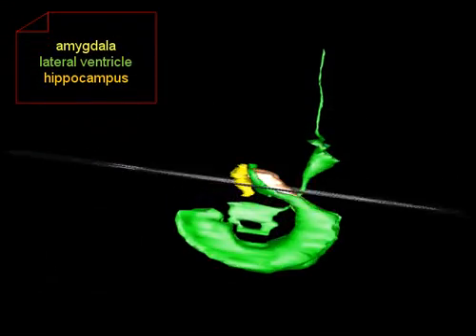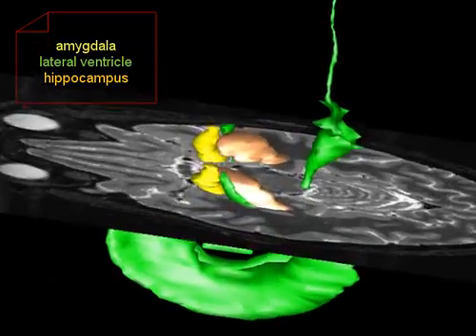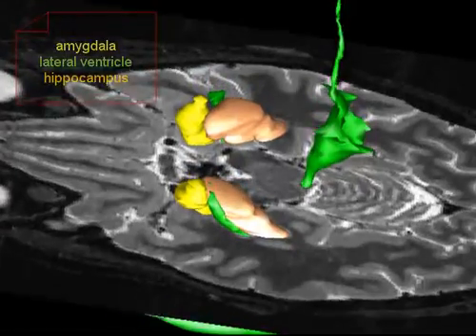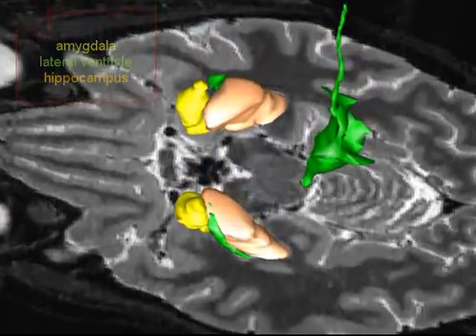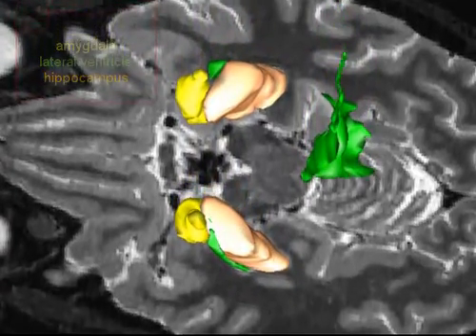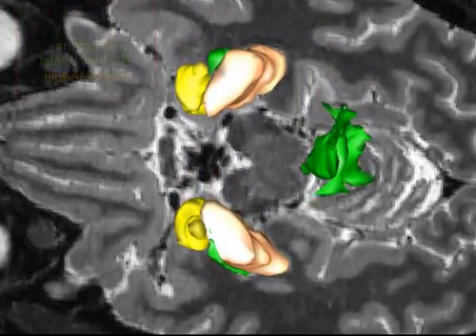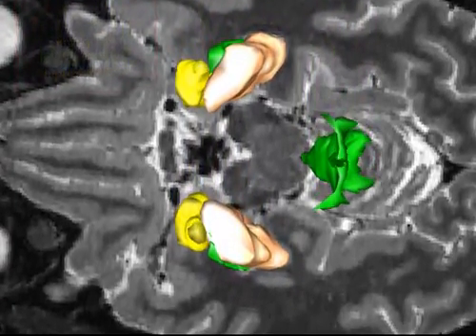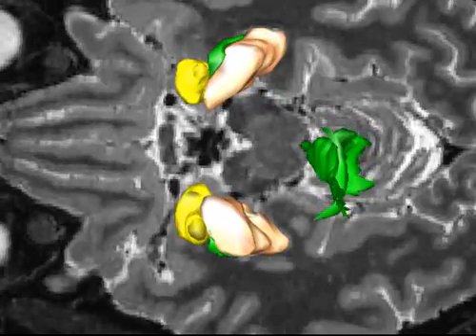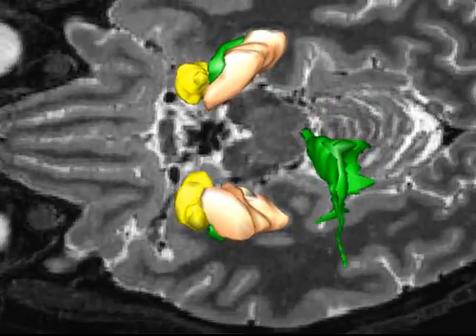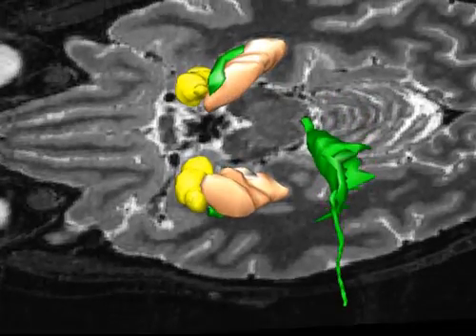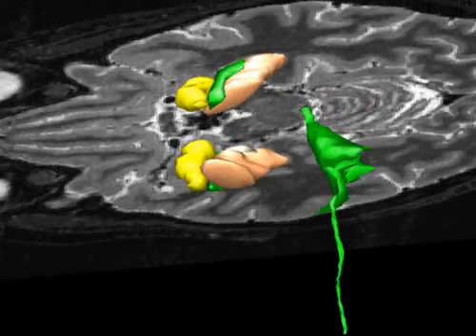Going from anterior to posterior in a frontal MRI series, you will first see the amygdala, then the tip of the inferior horn of the lateral ventricle, and then the hippocampus.